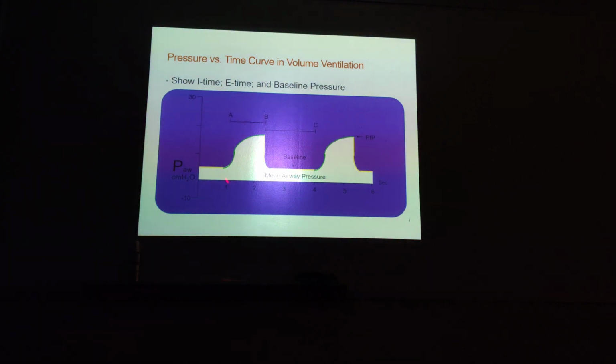So on the exam, they may show you this and tell you how much PEEP the patient is on. Well, if it's elevated 10 points, then a PEEP of 10. If it's elevated 15 points, then a PEEP of 15. And here's my mean airway pressure, which is the average pressure under a respiratory cycle, inspiration and exhalation, your mean airway pressure.